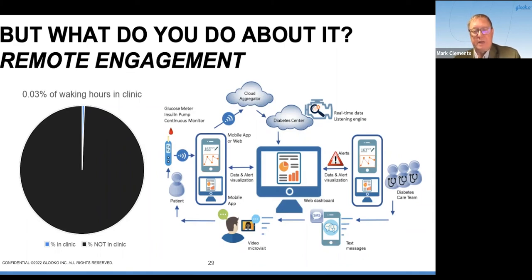So years ago, I conceptualized this approach to diabetes care that I jotted down on the back of a napkin. And here you can see my slide-based rendering of it: an individual could share their data to a cloud via a mobile app or a direct cellular connection. The diabetes center could aggregate the data from multiple external cloud sources, bring the data down into a data visualization web dashboard, and create alerts from those data to alert the diabetes care team to clinically significant events. And then the diabetes care team might interact with the patient via digital tools such as text messaging or video micro visits.